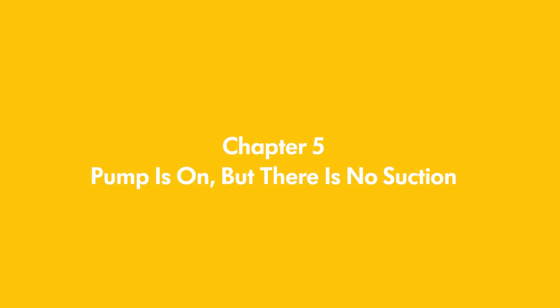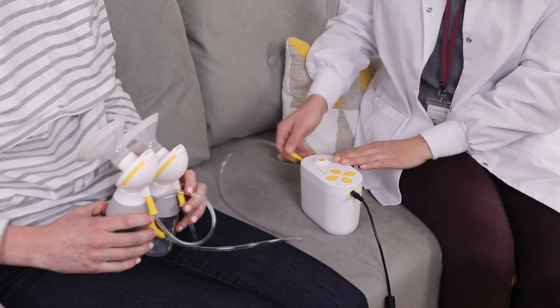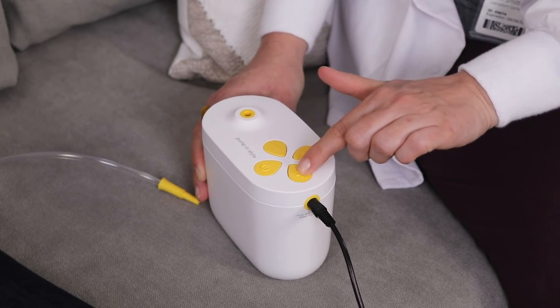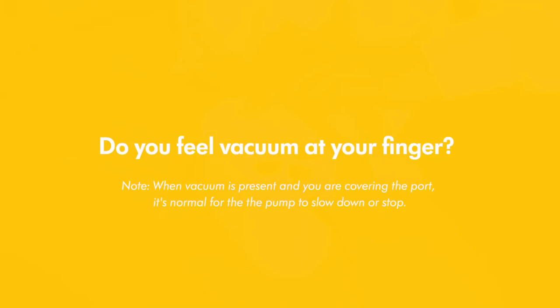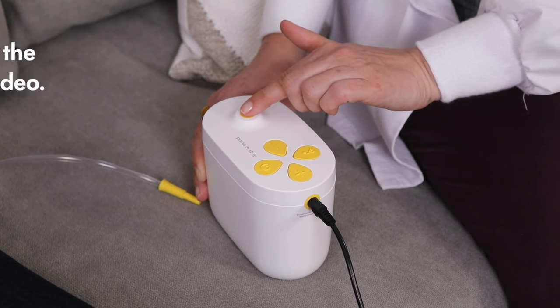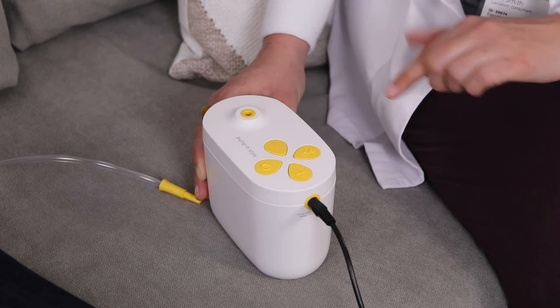If the pump appears to be on and you can hear it but there is no suction, here is a quick way to check for a possible cause. Begin by removing the tubing from the pump and then turn it on. Next, increase the vacuum by pressing the plus button multiple times and place your finger on the tubing port. Do you feel vacuum at your finger? If you do not, please call Medela Customer Service. If you feel vacuum on your finger, the pump kit may have an issue. Refer to Chapter 3 of the Low or No Vacuum video for more information.